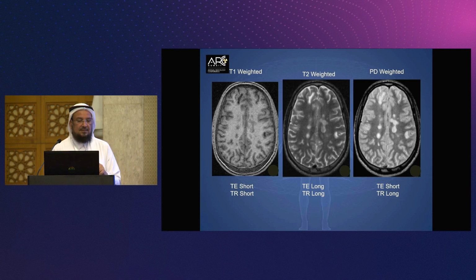For example, this is a T1 weighted image, meaning it's a mapping of the T1 characteristic of the tissue. You remember some tissues recover fast, some recover slow. So when you look at these images, the dark areas recover very slowly, while the bright ones recover fast. From this, we can understand that this reflects the recovery of the protons.